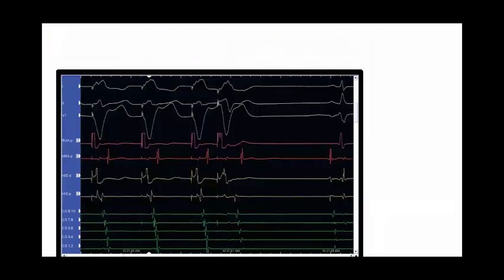With ventricular pacing, I am assessing whether I am capturing the ventricle, whether I am causing retrograde conduction or not, and where the conduction occurs first in the atrial catheters, and here I see it's in the His region. Another thing is that with conduction via the normal conduction system and the AV node, I find what's called decremental conduction.